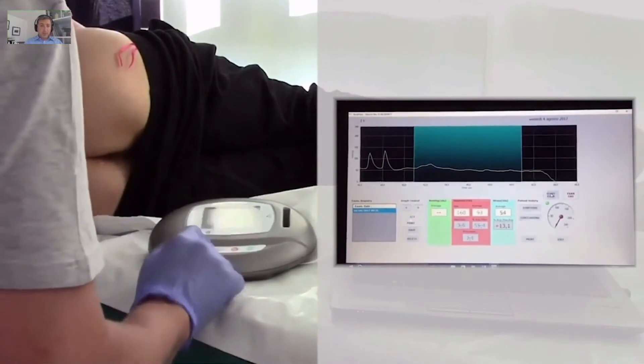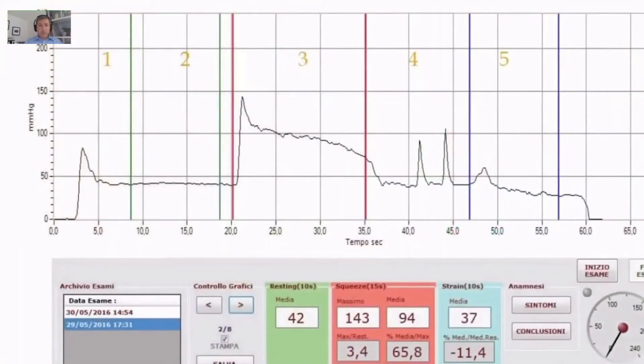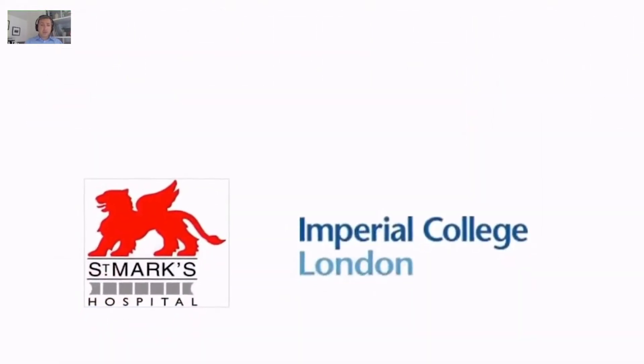And you see that on the screen. It's quite a straightforward procedure, very easy to perform. This is just a template — you see the nice line. It records resting pressure, squeeze, and involuntary squeezes.